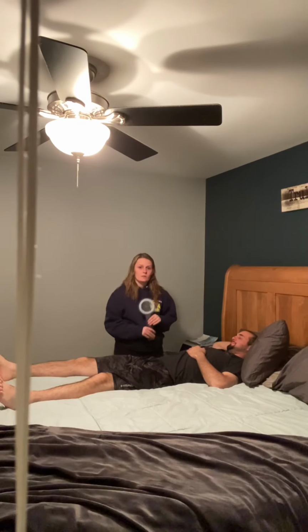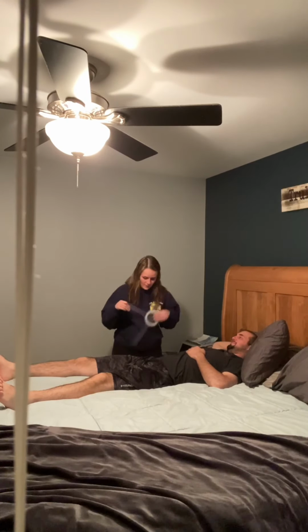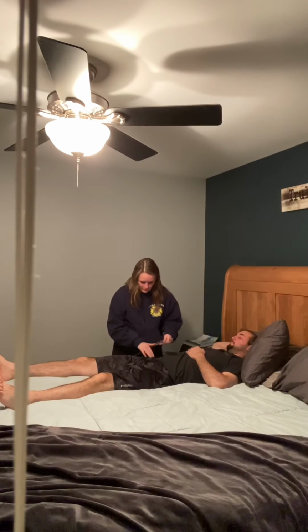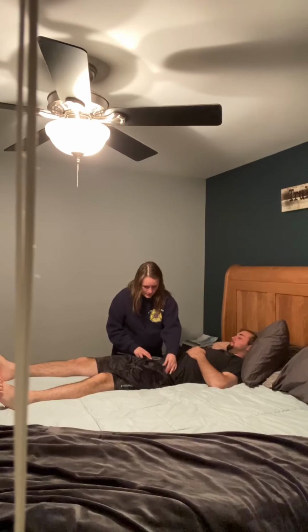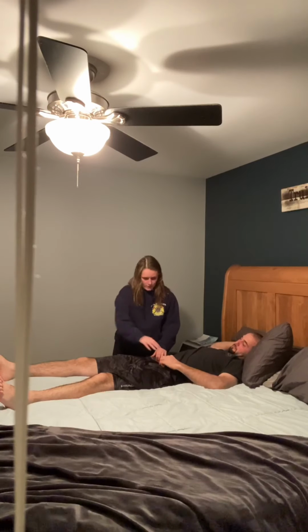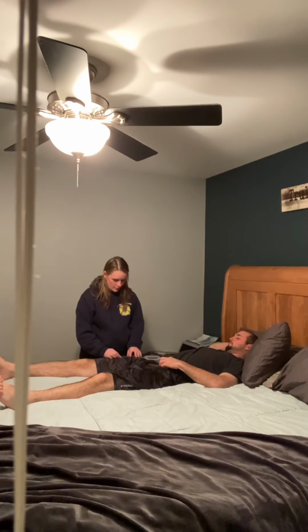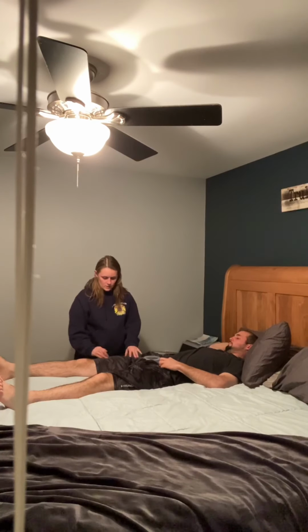So this video is going to be for hip abduction and hip adduction using the goniometer. You are going to line your fulcrum up of the leg you are moving to the ASIS, and then draw an imaginary line over to the opposite ASIS for the stationary arm. You are going to have your patient hold the stationary arm if they're able, and then your moving arm is going to line up with the anterior midline of the femur using the midpoint of the patella as a guideline.